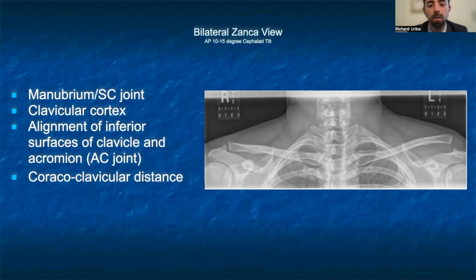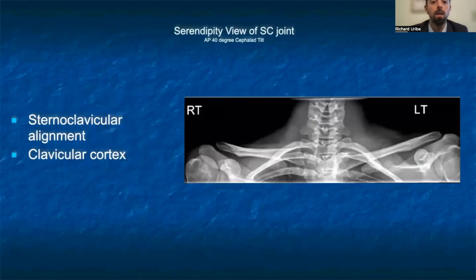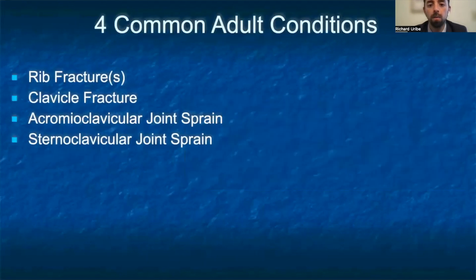This particular x-ray shows an acromioclavicular sprain on the left side. The third common x-ray view we will discuss is the serendipity view, which is an anterior-posterior projection with a 40 degree cephalic tilt, best at assessing the sternoclavicular joint or dislocation. The four common adult conditions we'll discuss are rib fractures, clavicle fractures, acromioclavicular joint sprains, and sternoclavicular joint sprains.